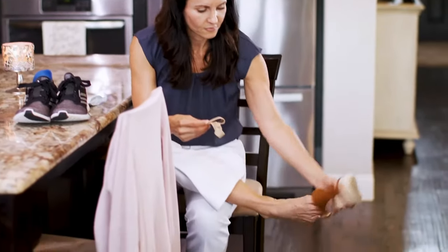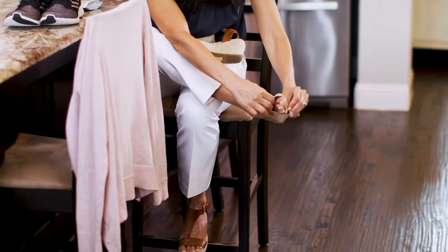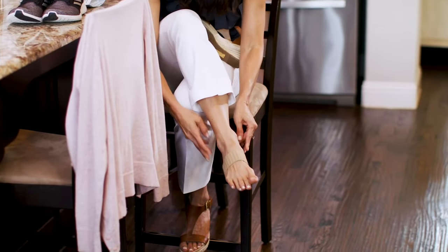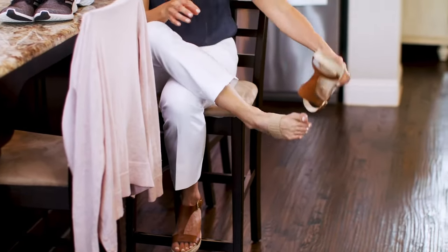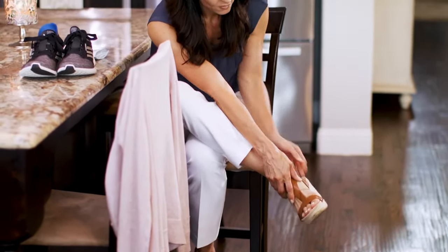Simply place the large main strap around your foot, just behind the ball of the foot. Place the smaller X-Strap towards your heel. Make sure the X-Strap crosses on the bottom of your foot. Place the loop portion around your heel. It's that easy.